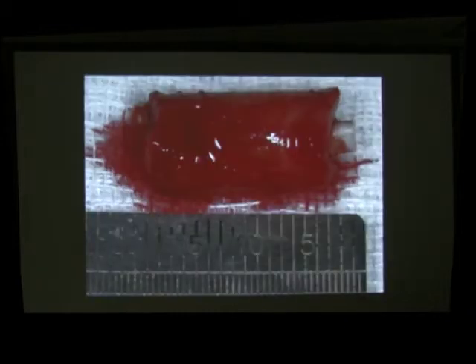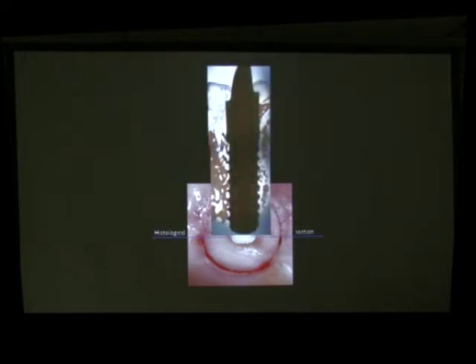This is the implant. It's a CeraRoot 12. It's an implant designed for upper laterals or lower incisors. This implant was placed in the area of the upper left canine, and we decided that the most important area that we wanted to see was right in the middle of the implant. So we gave instructions to do most of the histological analysis at the biggest diameter area, and especially at the shoulder level, so we could see what was underneath the gum.